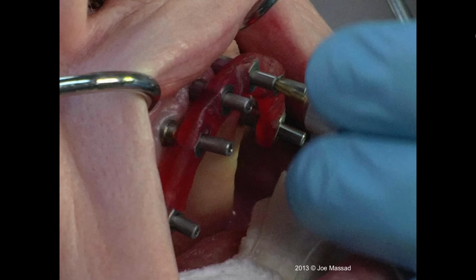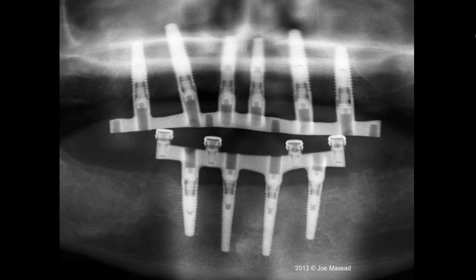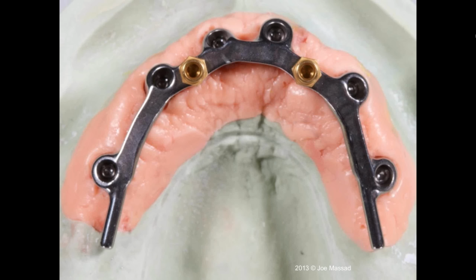We radiographed these to be fine, and then the models were scanned after the prosthesis was in its waxed form, so we could scan the amount of room we needed and the bar design. So when we completed the bar, if you'll see, we put in two of these micro ERAs. The locators are a little too wide in this case, so I use these micro ERAs. And on the posterior, very similar, it'd be like the Hader clip and bar here, and we'll use the gold clips on this case.